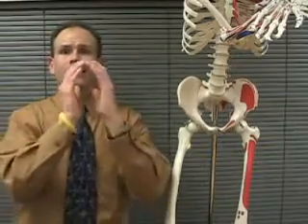Unfortunately, it tends to overestimate the percent body fat for an individual, because instead of getting a nice fold that we can pull away from the muscle and underlying tissue, we actually get kind of a mound of skin and fat. And that mound tends to be a lot wider and therefore a bigger measurement than if we could actually get the subcutaneous fat and pull it away from the muscle and get a good measurement.